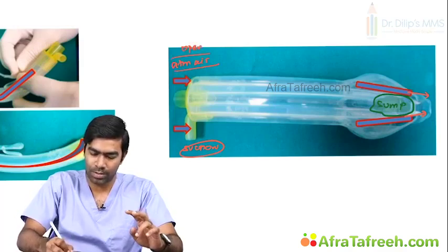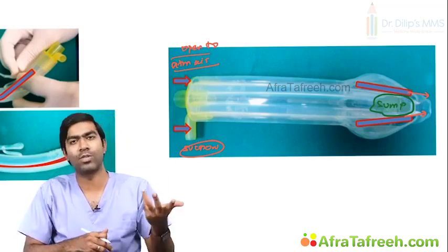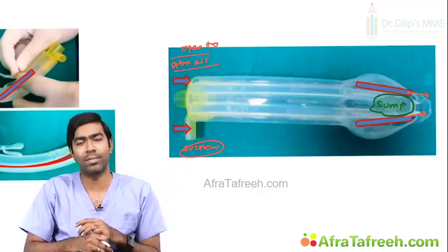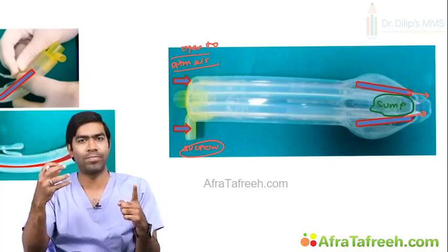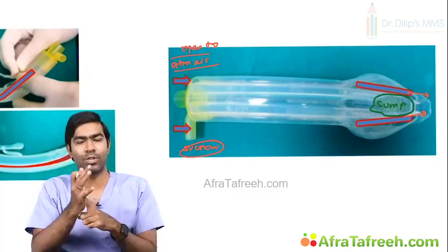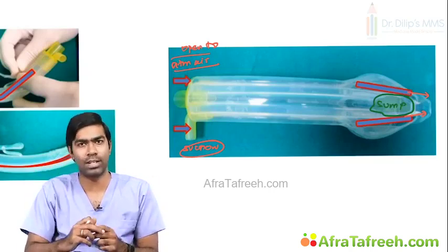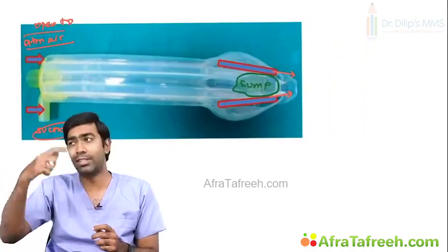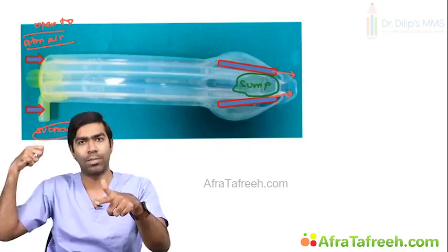I told you why the gastric drain or the esophageal drain is useless on a traditional second generation LMA: because of the negative pressure created, it takes a chunk of esophageal tissue and impinges on it so that the accumulated secretions don't come out at all. But here, both the ports are leading to the same sump and one is connected to the atmosphere.